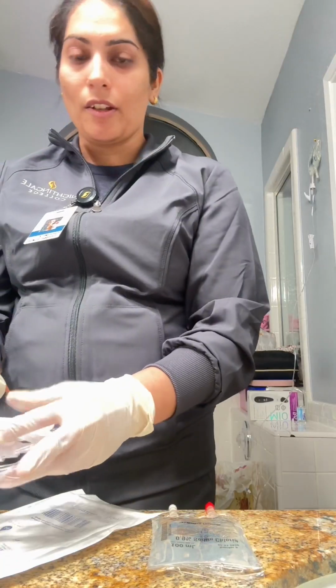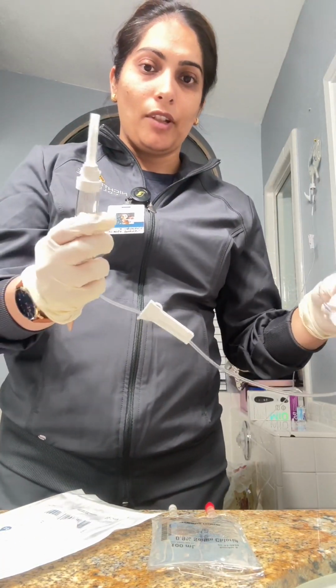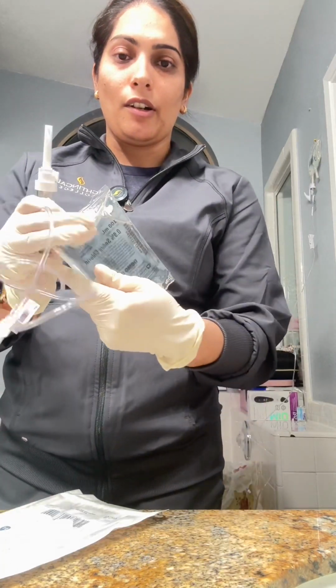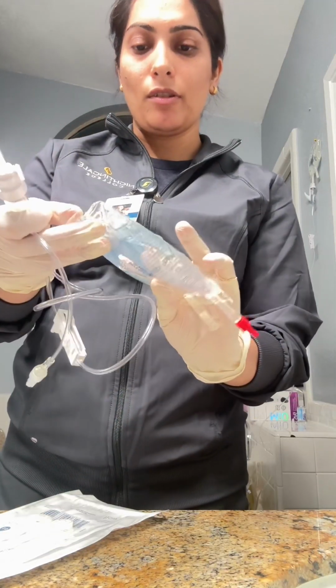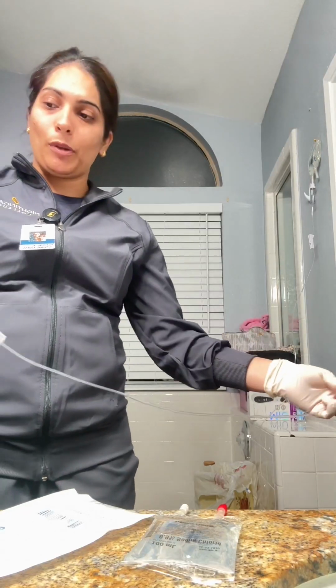And this is our secondary IV tubing right here, and this will be used for the medication, which is the right medication. And I will be priming this.